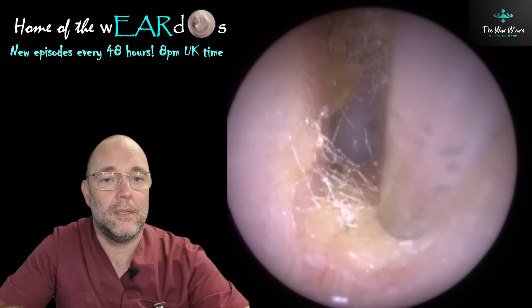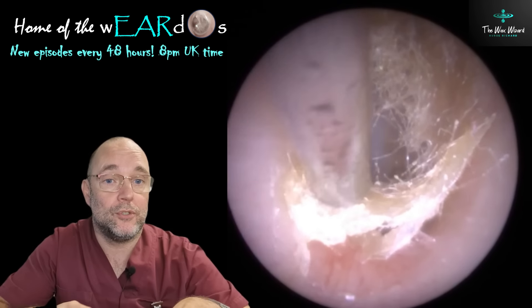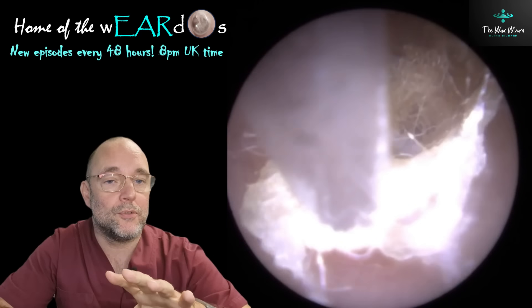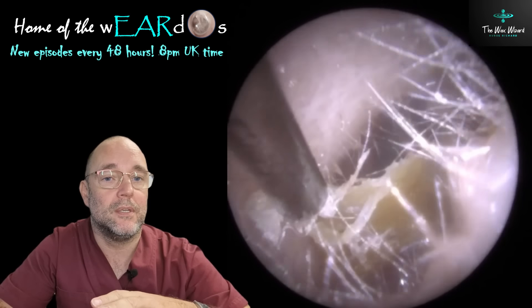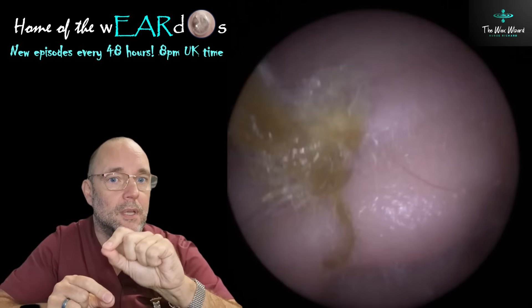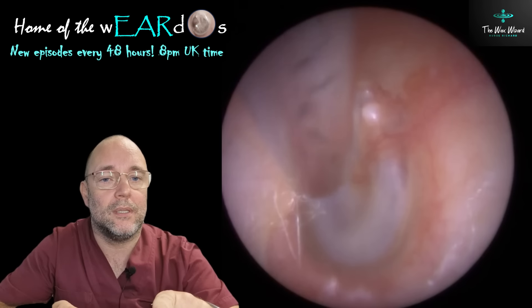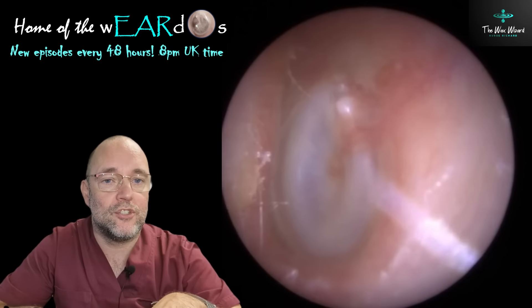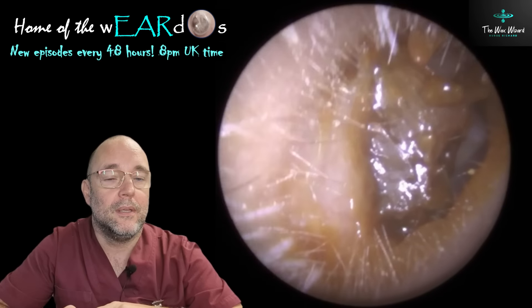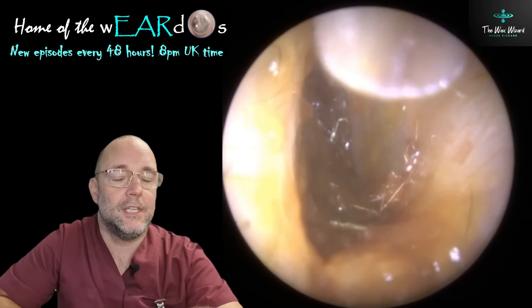You will see some difference between a lot of different practitioners. In the Far East, East Asian channels, which you'll see quite a lot, you'll see them using cawthorn hooks and things like that quite commonly. Those usually are the best things for those type of procedures because people of a Western descent tend to have a wetter earwax. Tools, and especially the cawthorn hooks — the little metal L-shaped hook that you'll see — will just slice through all of that. People of an Eastern Asian heritage tend to have a bit of a drier earwax, so you can get these harder, drier things which are much more easy to scoop out with those hooks. But Western wax is traditionally a bit wetter, like this one here.